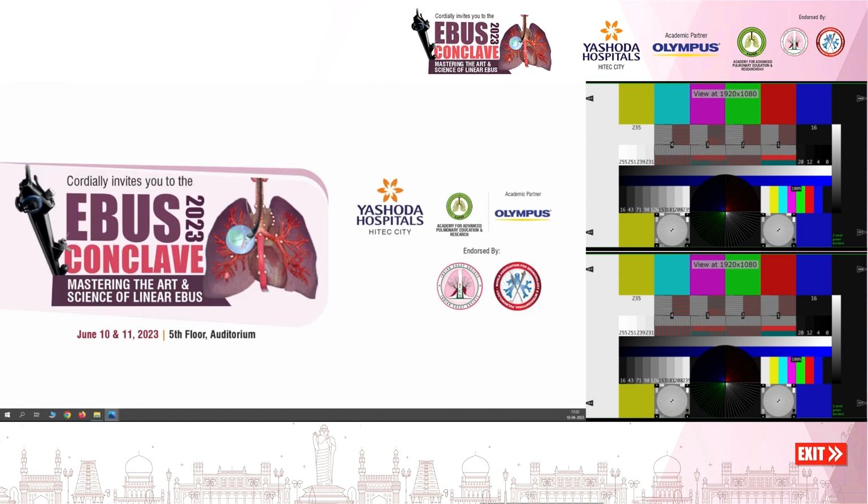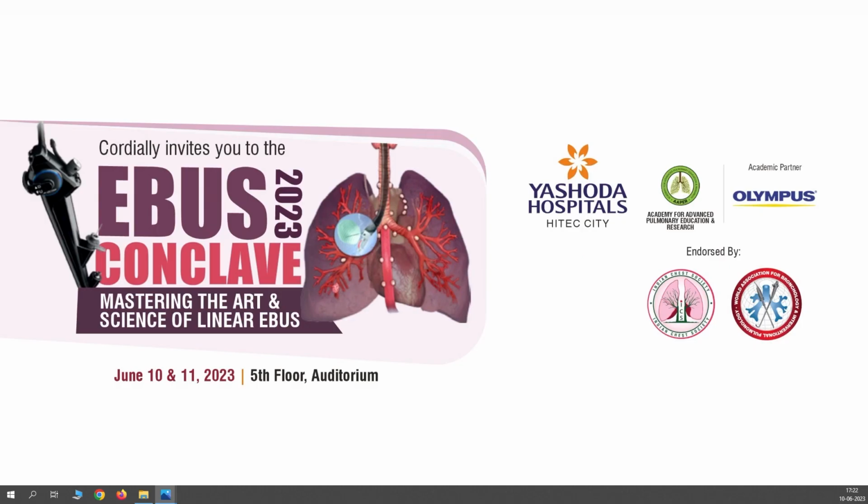So the one last thing I wanted to add was that the N3 node is labeled separately, N2 is labeled separately, and N1. And between passes, we need to rinse the needle with saline to avoid contamination. Previously, people used to try different needles at different stations, but that is not practically possible. So we at least rinse it after each station so that we don't mix up.